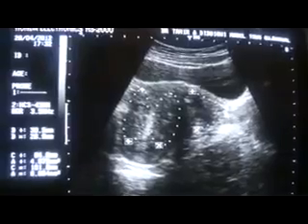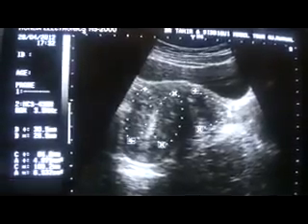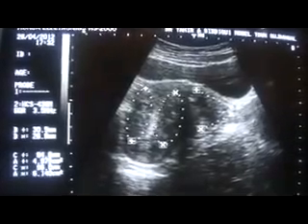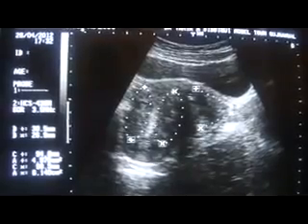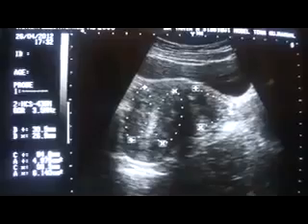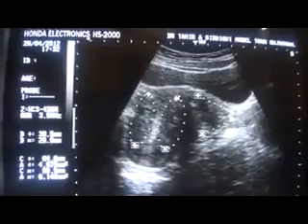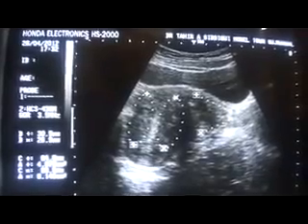We can only see this is the follicle. Here is the second ovary with follicular activity. This is the second ovary with follicular activity. So we have studied a retroverted uterus.